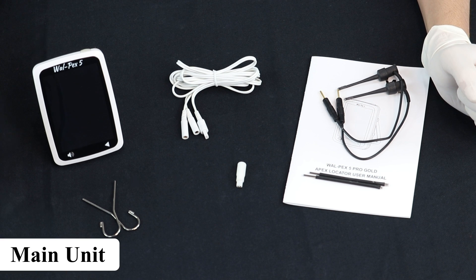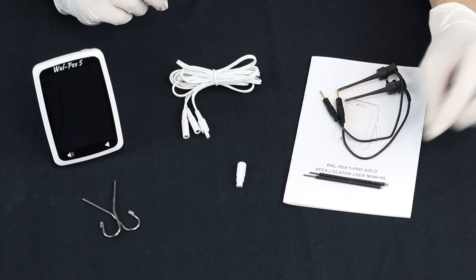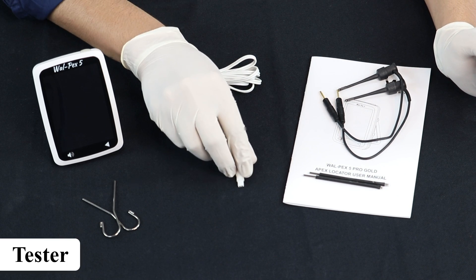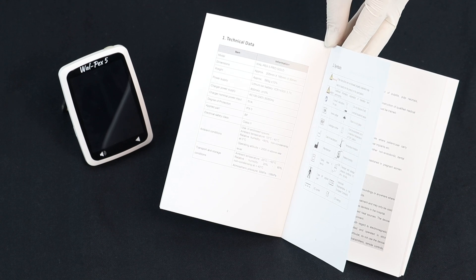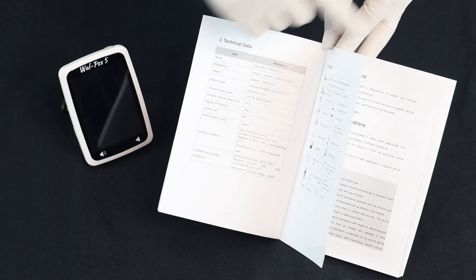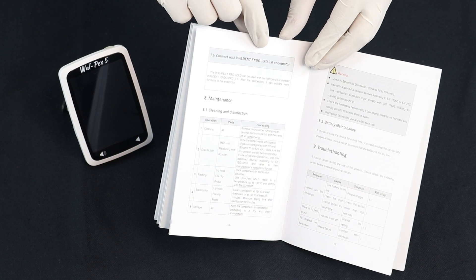Let's see what all we have in the package. This is the main unit, measuring wire, file clip, touch probe, tester, clip hook, and the instruction manual. The instruction manual provided has all the details including specification, installation process, maintenance, troubleshooting, etc.